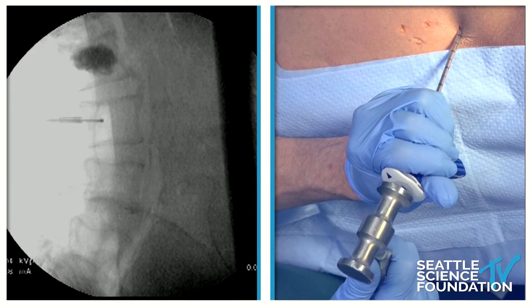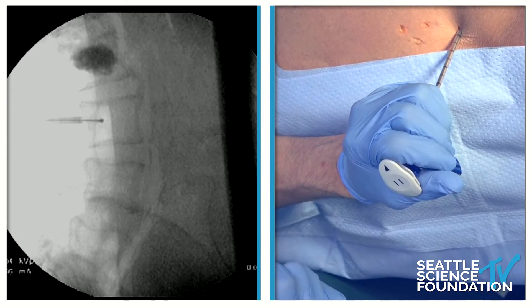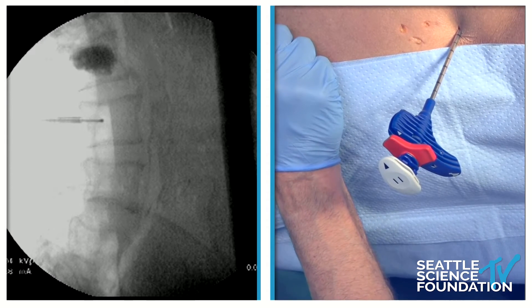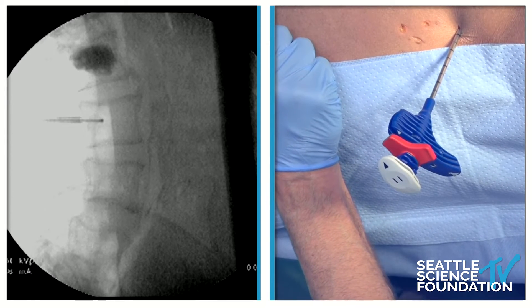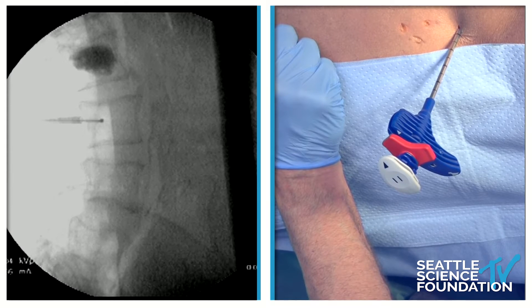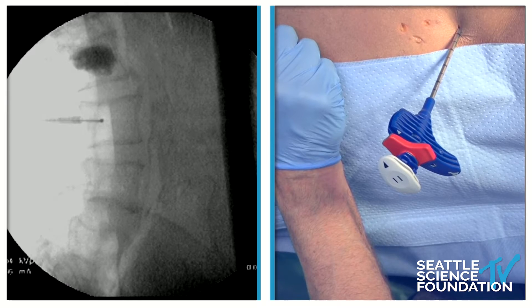That's exactly what we want to see. The expanded distal tip — the spatula — now becomes a dot, so we know this is moving directly toward us. This is about 70-75% from the front to the back, and we're 50% from top to bottom.